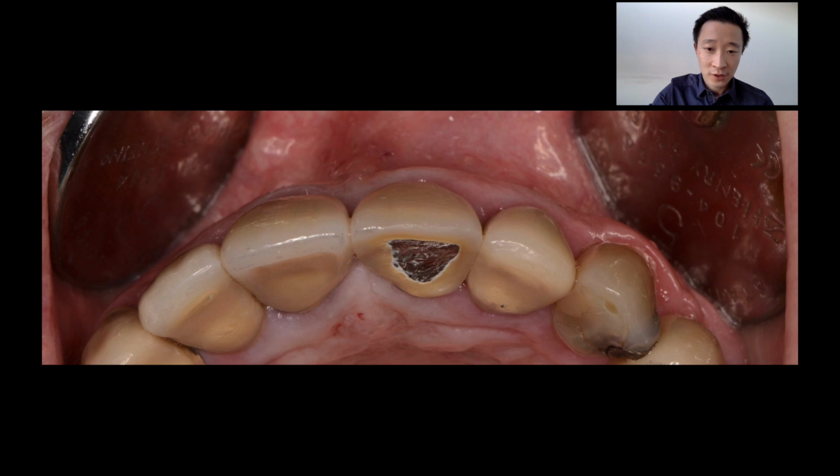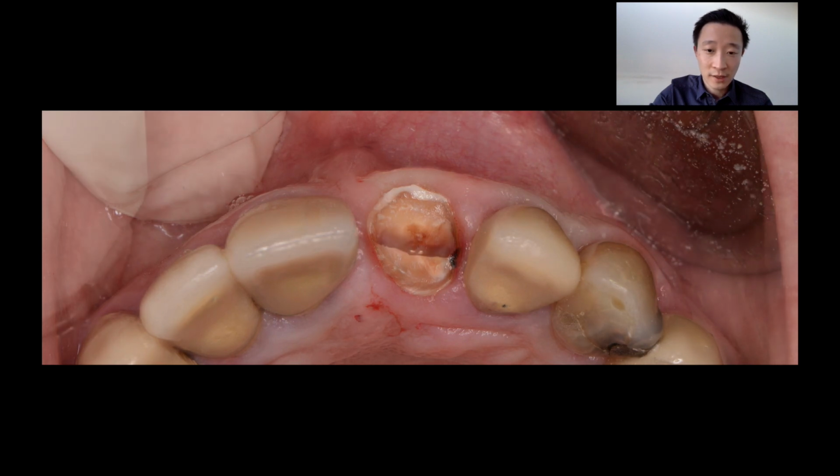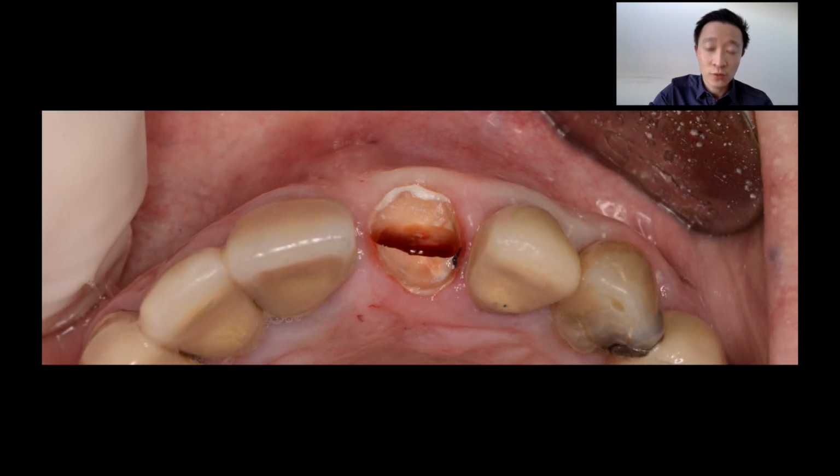So this is the day of surgery, occlusal view. Something to note is the buccal emergence or buccal prominence of the tissue that is a result of those roots. This is something we want to keep an eye on as we progress through healing. The crown is removed, and then the sectioning or the root preparation starts, the socket shield preparation.